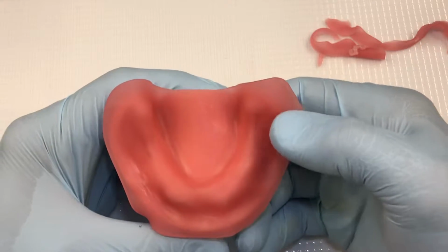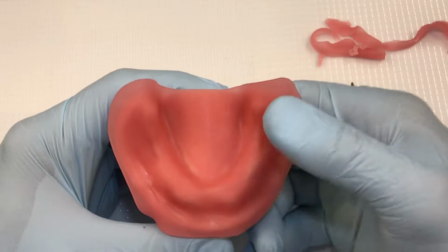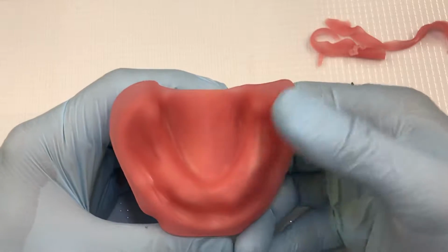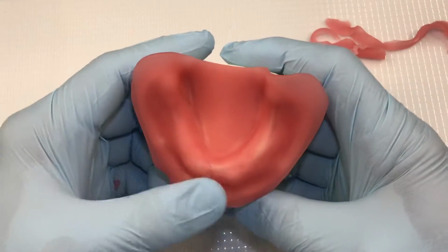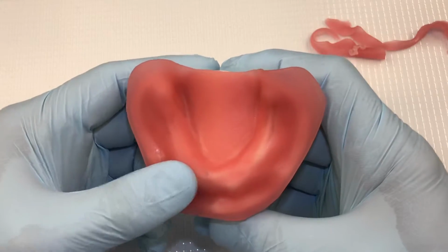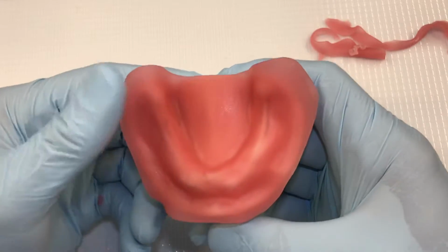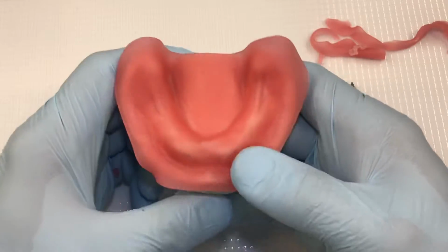So unlike the upper where I thinned it out on the facial aspect of the ridge, now I'm going to thin it right on top. So I'm going to put some extra pressure right on top of it and maybe a little bit facially to the anterior portion right here, where I anticipate interference with my setup.